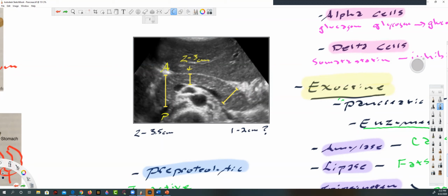You can clearly see that this tail is wider than the body here. So I would circle that question mark. Besides, I'm not overly concerned about this obvious discrepancy. The number one measurement is the head. That's the number one measurement that doctors look for.